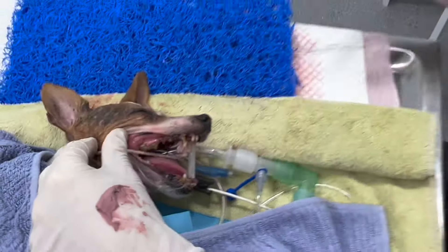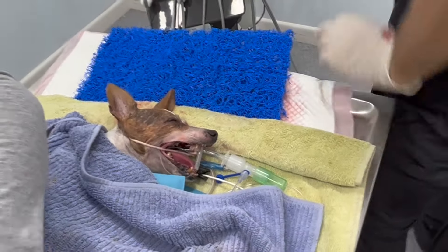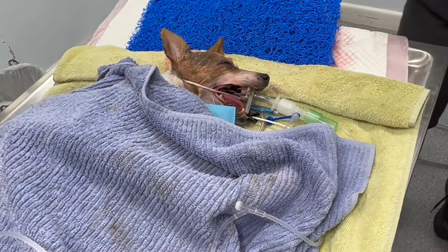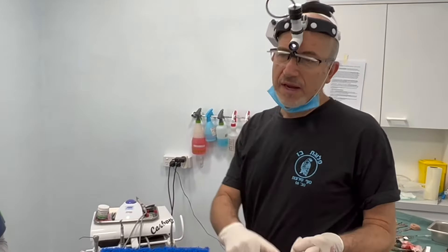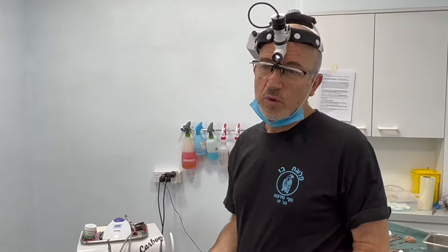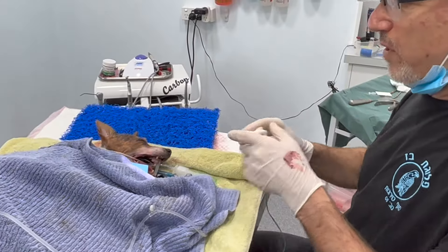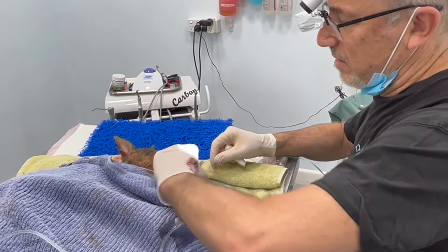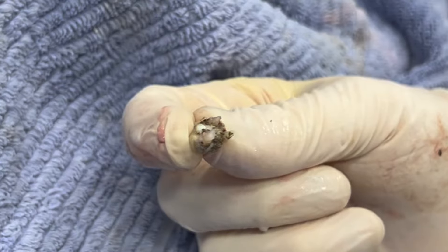That would be painful and infected. Remember: the aim of a dog dental is to take away pain and infection — it's not to get a mouth full of teeth. No pain, no infection — they don't need all their teeth. It's better to save teeth when possible, and this dog is 14. The owner may not come back for further treatment, so I've got to do as much as I can on this visit.